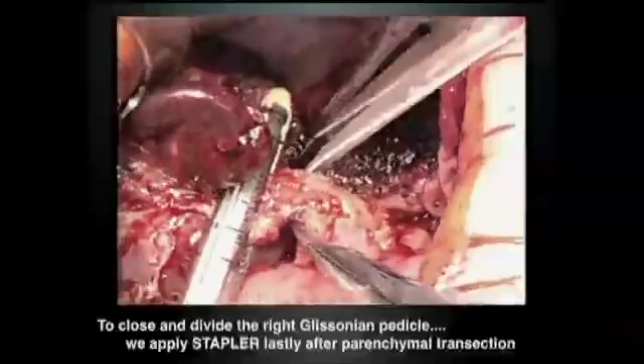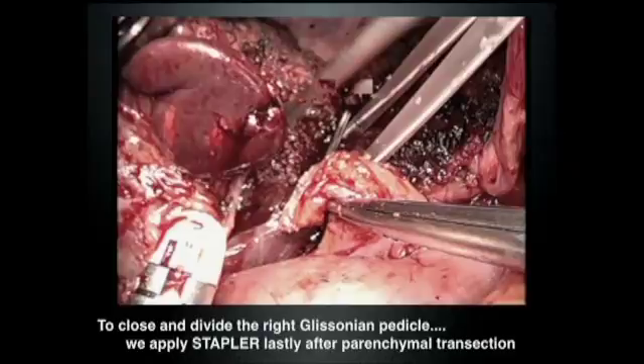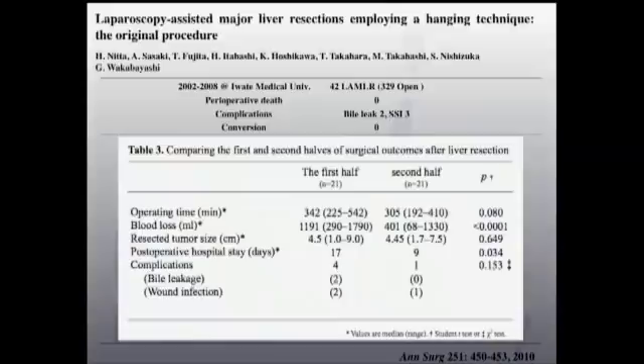I'd like to emphasize that the stapler has to be placed at the last stage, after parenchyma transection. Sometimes the left hepatic duct comes in from an anomalous direction, so you might cause a stricture of the left bile duct. It is better to place the stapler as distal as possible from the central hepatic hilum.